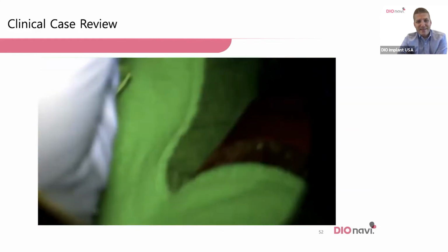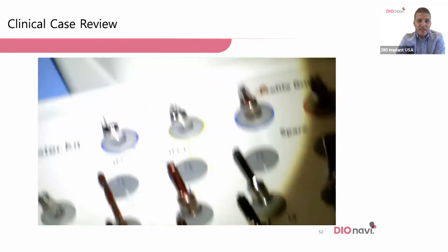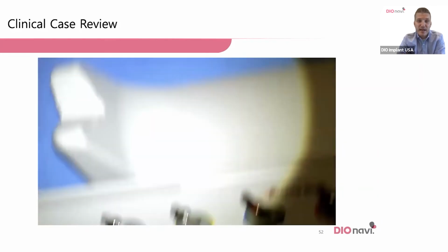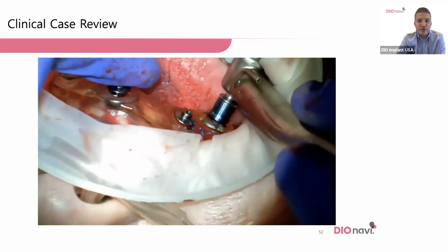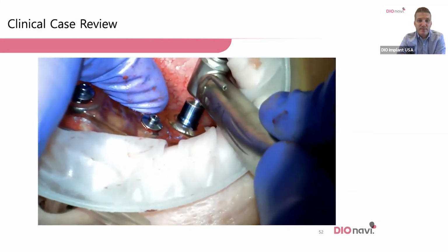I edited a few seconds of just my head moving between drills. Otherwise, what you're seeing is complete real time without any big edits. I wanted you to see what this procedure really looks like in terms of real time. I'm not rushing here. This is just normal working speed. So here's the next drill, a little shorter depth stop. So I'm going to get down at least another millimeter here.